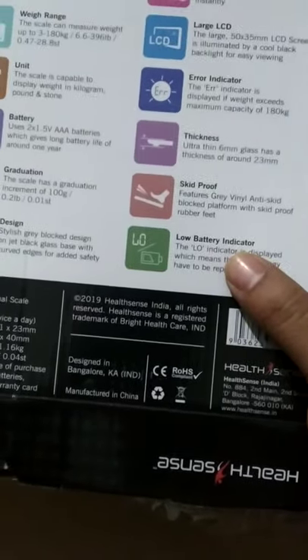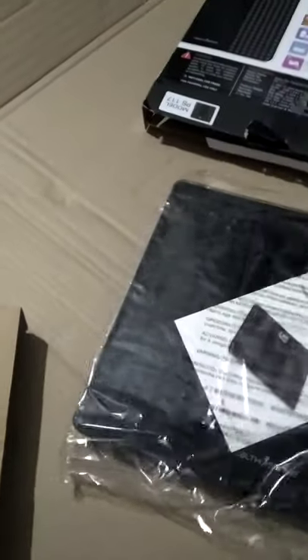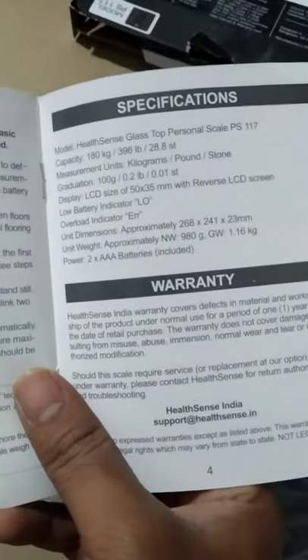This is brand new — I bought it from Amazon. They give up to one year of warranty. It is skid-proof, and the thickness is one of the best. I bought this model last year also — this weighing scale machine is one of the best. I'll open it and show you.